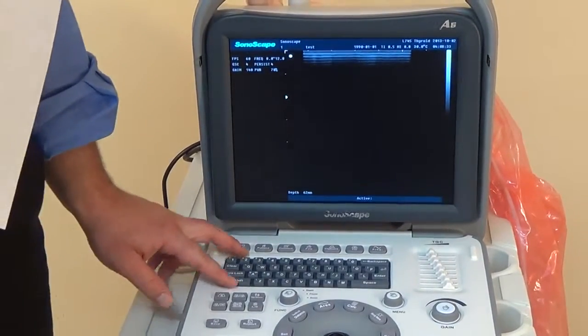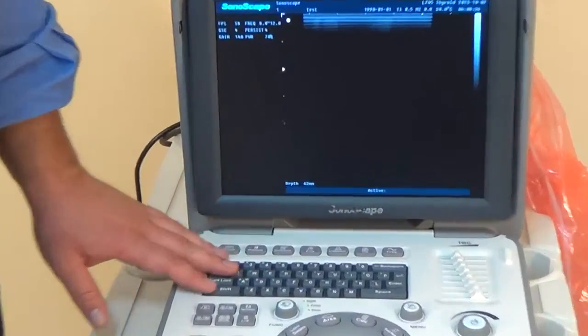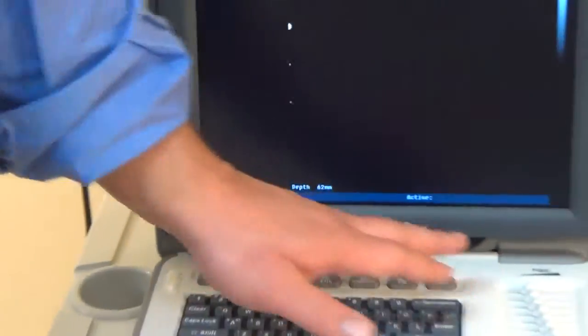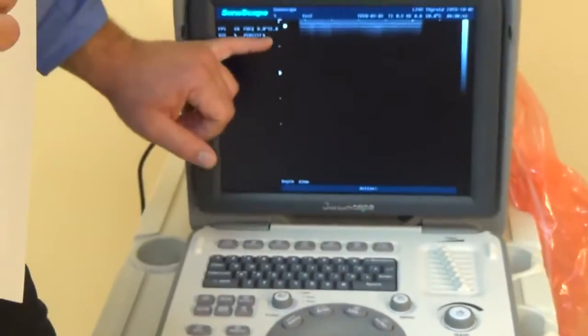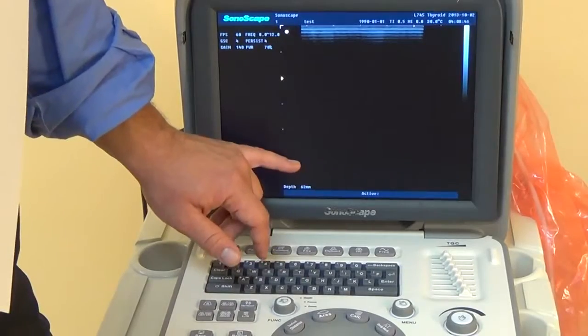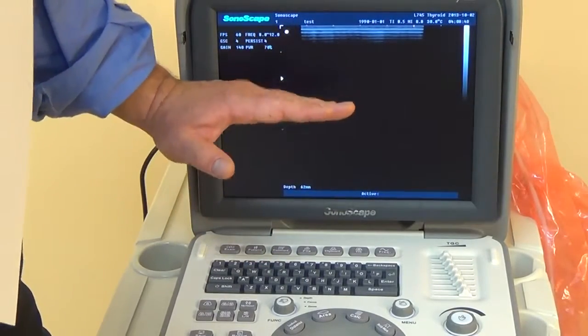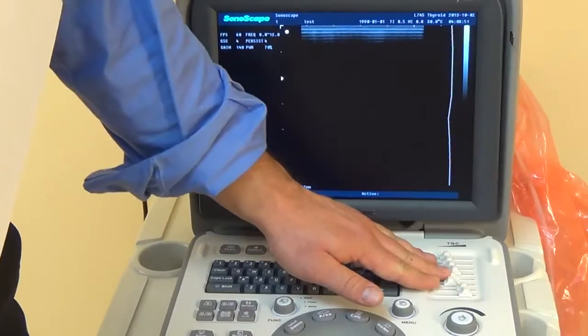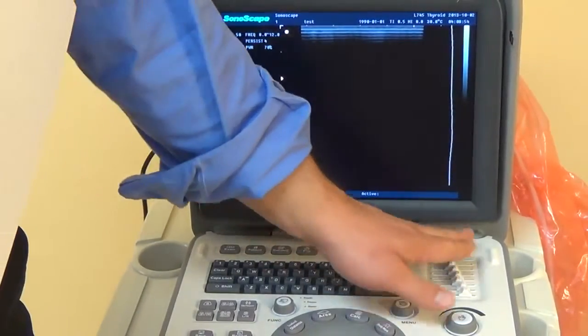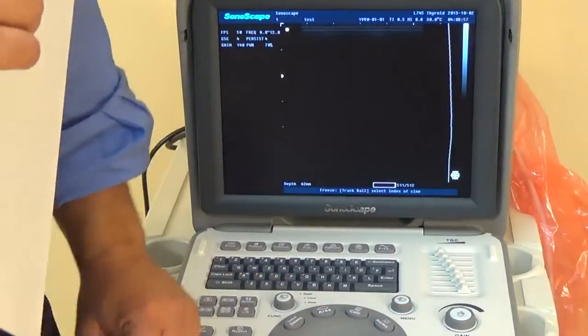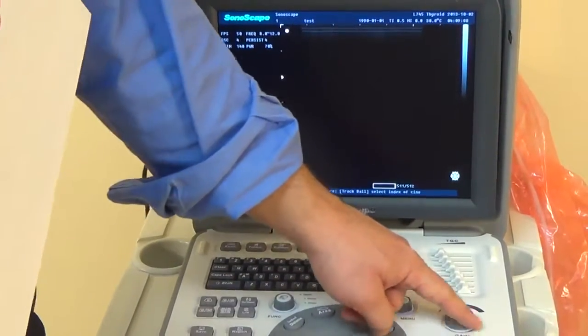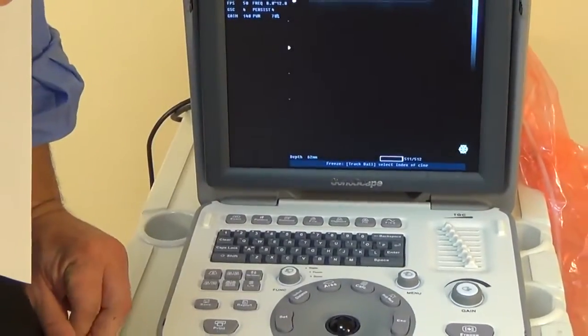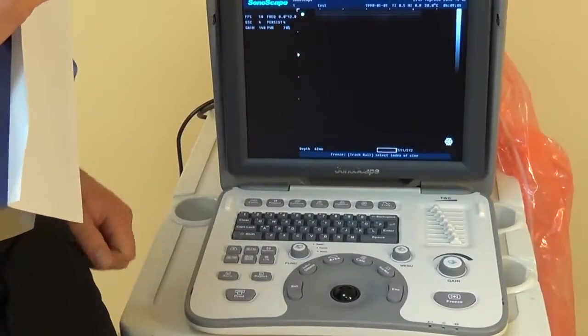Obviously, we have keyboard. That's pretty much self-explanatory. On this side over here, we have the TGCs. So what that allows you to do, each one of these allows you to adjust the gain on the screen. So if you have one part that's really low or dark, or if you're going for a dense tissue in one spot or the other, you can adjust those, and it gives you a line bar here to show. Usually people have it kind of lined up in the middle or slightly off-center. Overall gain is right here. You can just increase that or decrease that. That's something that each user will be using to their own taste.